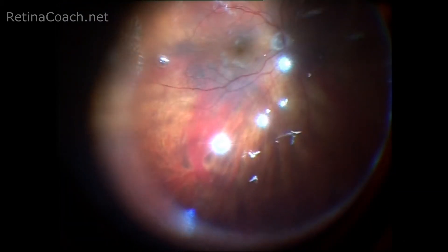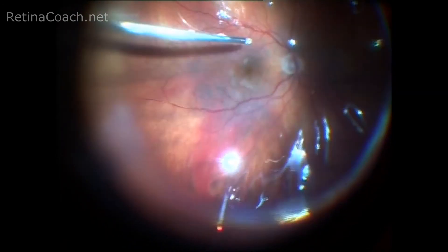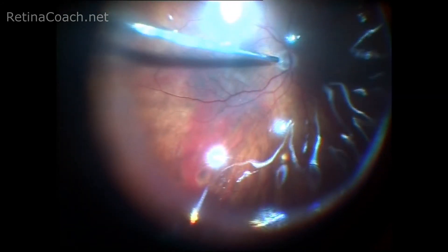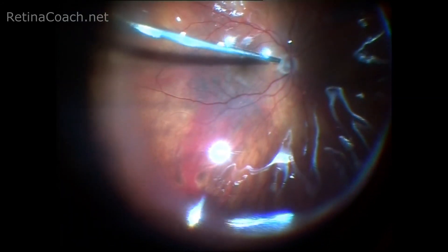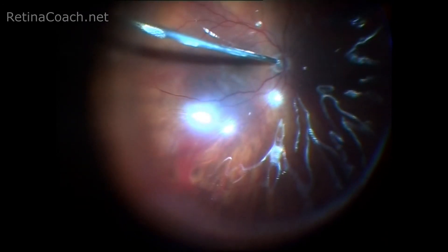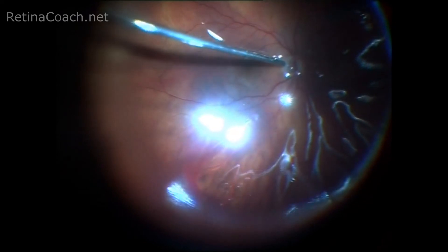Second, stay inside the PFC bubble with the cannula tip while aspirating. Third, when almost all PFC is removed, stay above the area of the optic nerve head or nasally to it. And fourth, wash out the PFC well, for example by using BSS solution.